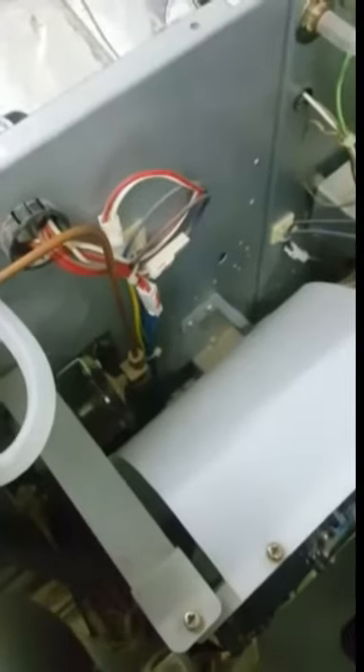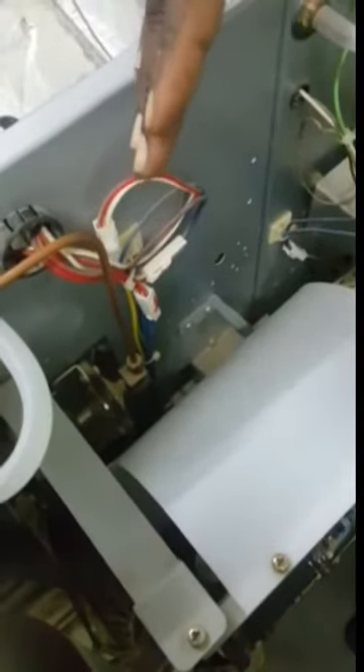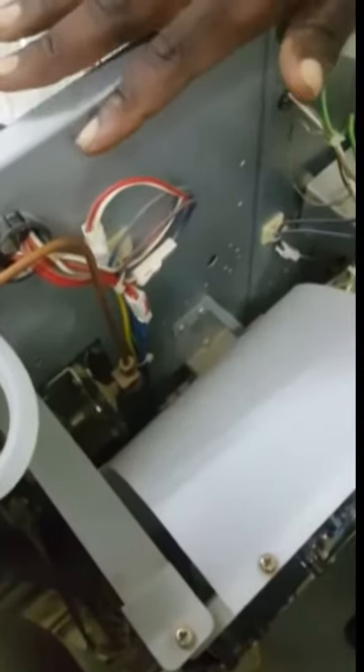If the door locking mechanism is not in good shape — this is the door locking mechanism — when you close the door, it automatically screws itself and tightens so that you cannot open it until the cycle is completed. There is a micro switch here; if that micro switch is damaged, you are likely not to get your door locked.